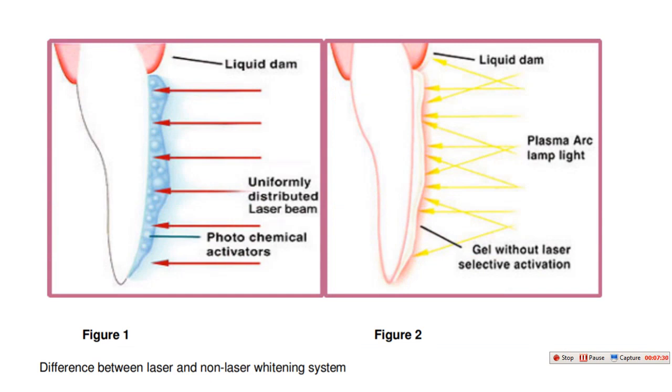In this picture, I will show you the difference between the conventional bleaching technique and the use of laser. The most important point in bleaching is to reduce post-operative pain or sensitivity. All techniques attempt to reduce this post-operative sensitivity. We must know two reactions, photochemical and photothermal. Photothermal mostly occurs in conventional bleaching with conventional light. Photothermal reaction means that the conventional light not only acts on the gel but also releases heat through the tooth structure, and this increases the incidence of postoperative sensitivity.